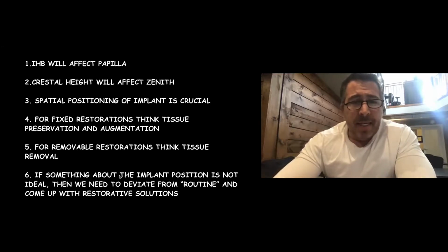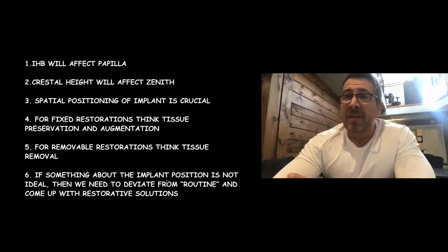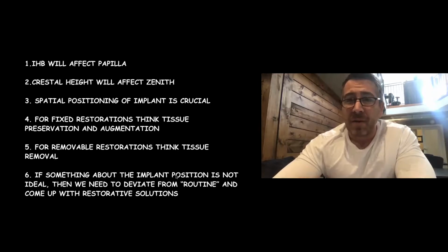And if something about the implant position is not ideal, then we deviate. Now we're doing corrective measures. So now we're trying to make things look nice with our bag of tricks, with our ceramic work.